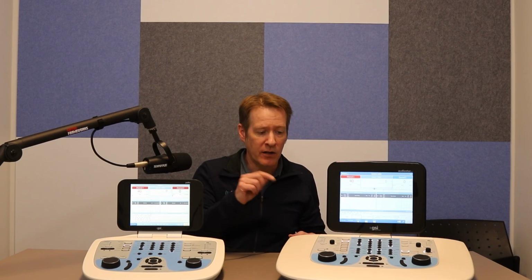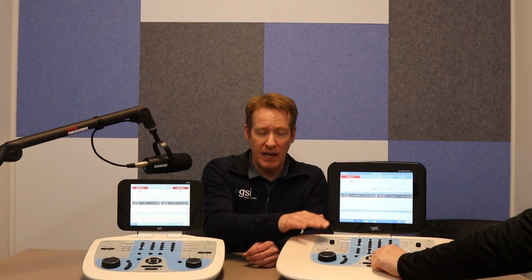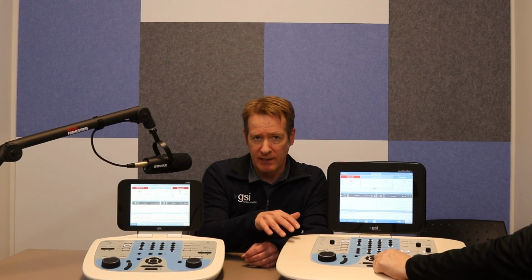So what we want to do is we want to decouple that, and you uncheck the auto advance. And what that will do is it'll allow you to hit correct and incorrect as many times as you like for each sentence. Now, in these instances, you will need to use the navigation controls, or you'll have to plug a mouse into the AudioStar Pro and click on the words to have them move through the sentences as you're doing this, because again, that counter is not going to move when you score it.